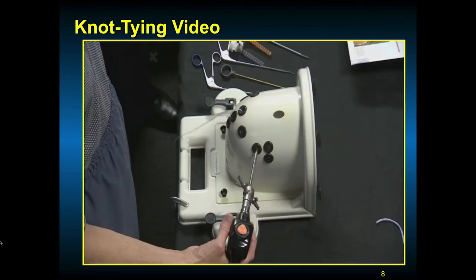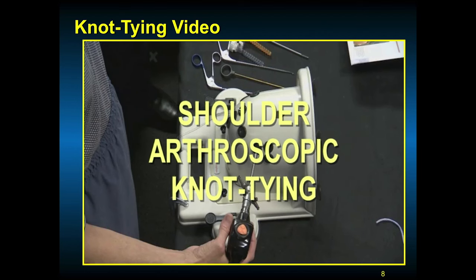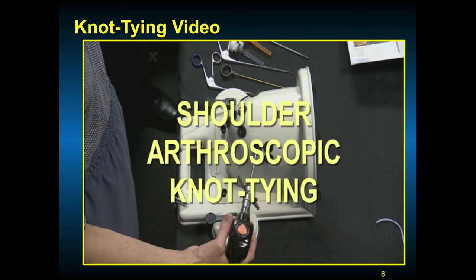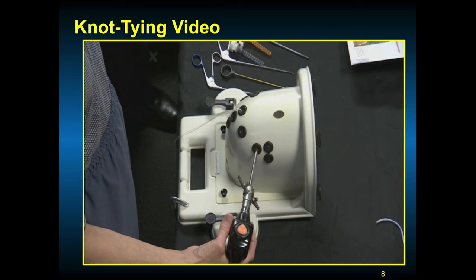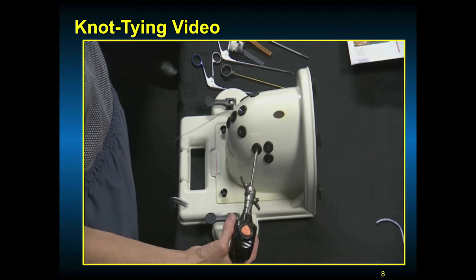This is a knot-tying video done on an Alex model. There are several different types of models you can practice on. Before you do your sports medicine rotations, it's very important to practice — like getting back on a bicycle. You don't want to be pushed away from the operating room table because your skills aren't there, so get into the wet lab and practice. To become proficient in arthroscopic surgery, one must practice, practice, practice. Having access to a shoulder model and knot-tying posts is very important. This is a SAM model — practice a lot before you get into live surgical action.